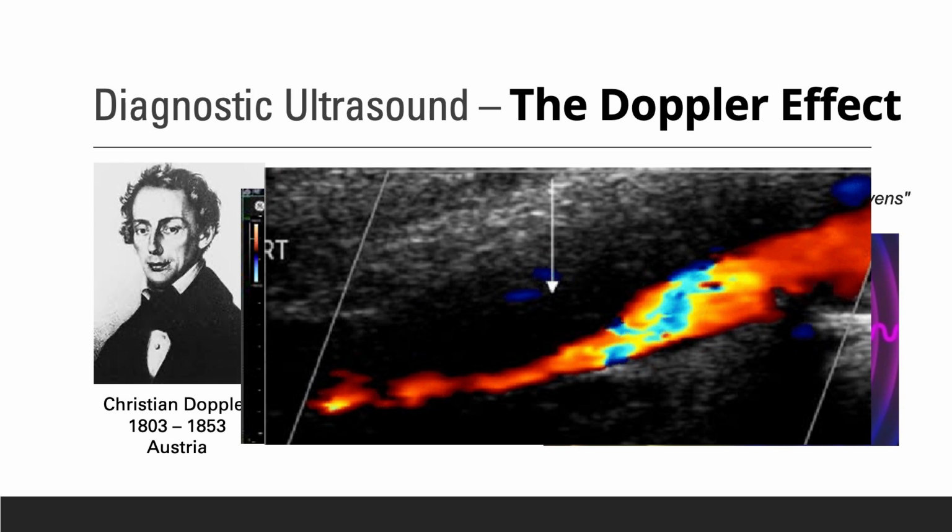What you'll be more familiar with is when you get the ambulances tearing past you, or a fire engine, where you get the change in pitch as they go past. And that's what we use. My pal here has got buttons on it that I've highlighted there. Most scans I would do, I would always use Doppler. There's very rarely an occasion where I wouldn't use Doppler. And I always say to the trainees, and I know some of them are listening, that when you write a report, when you write down Doppler, it's got to be a capital D, because it's the man's name, not a small d.